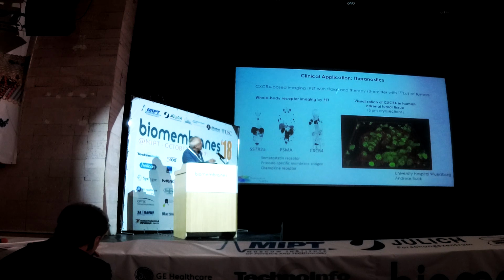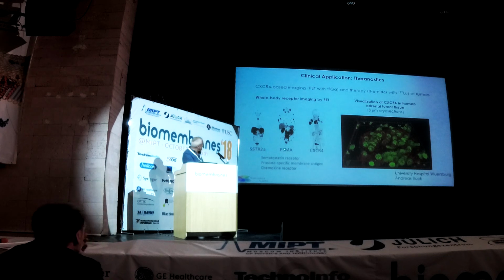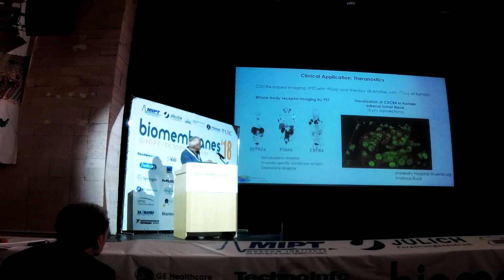And then you add isotopes like gallium-68, which emits positrons. Then you inject these antibodies and they bind to these receptors, and then you detect where these antibodies are sitting. This is for prostate-specific membrane antigen, and you see all these metastases in the body.